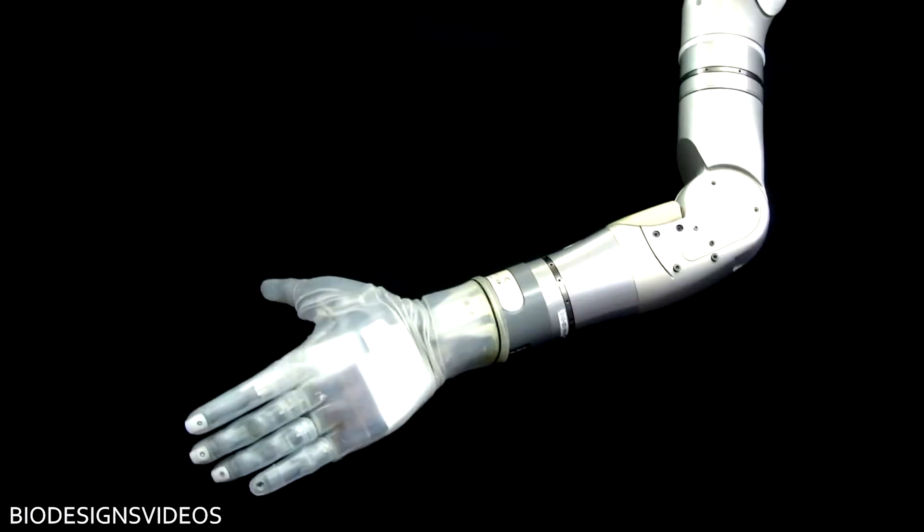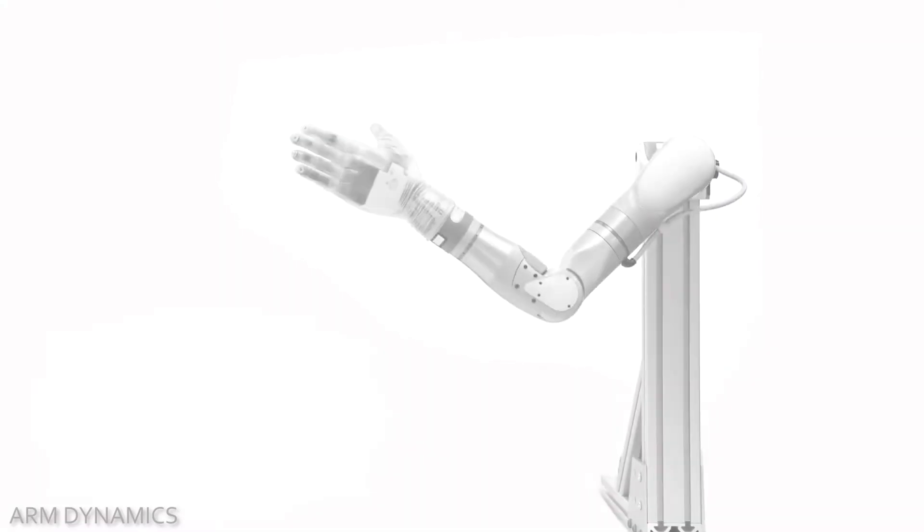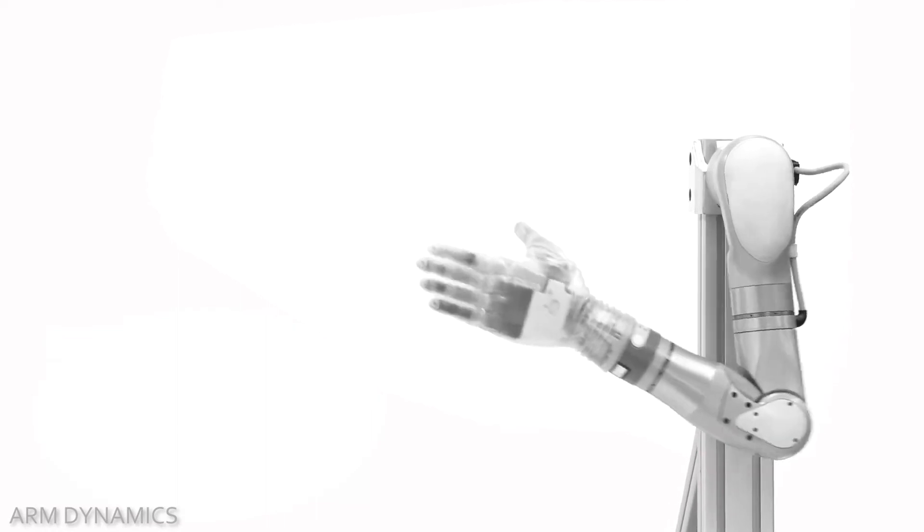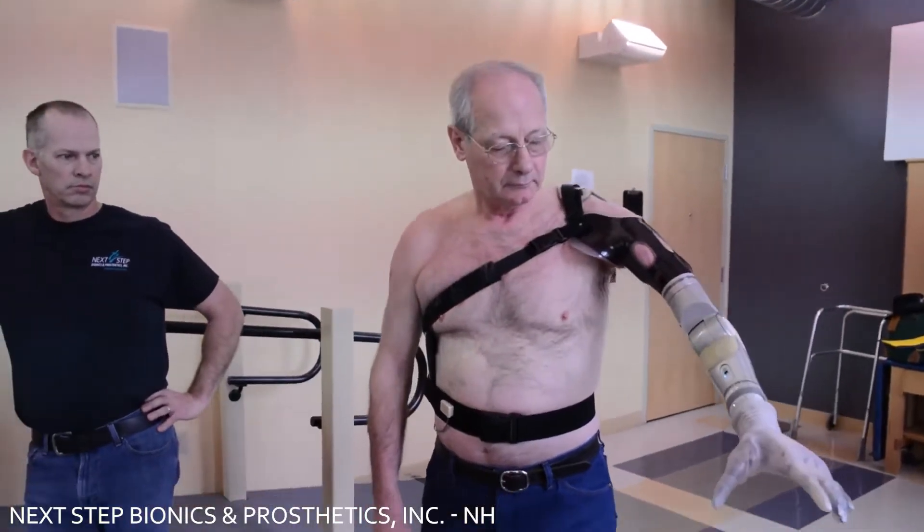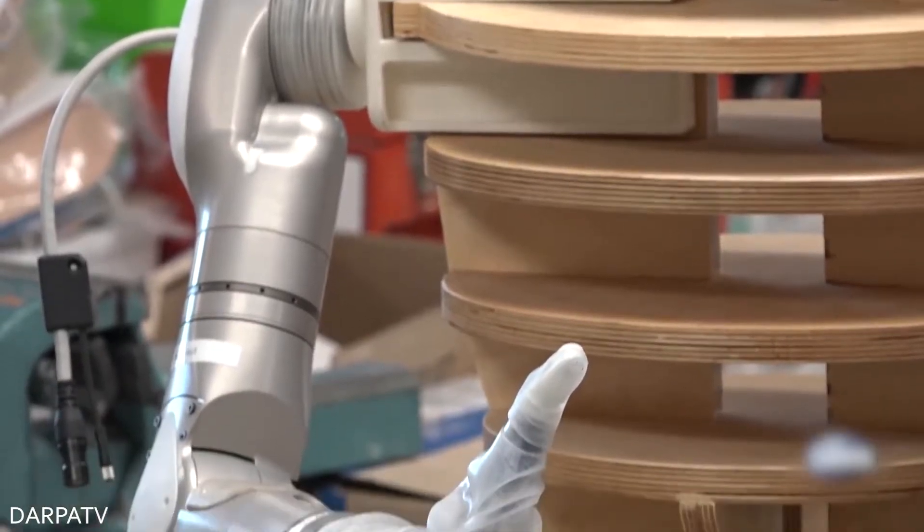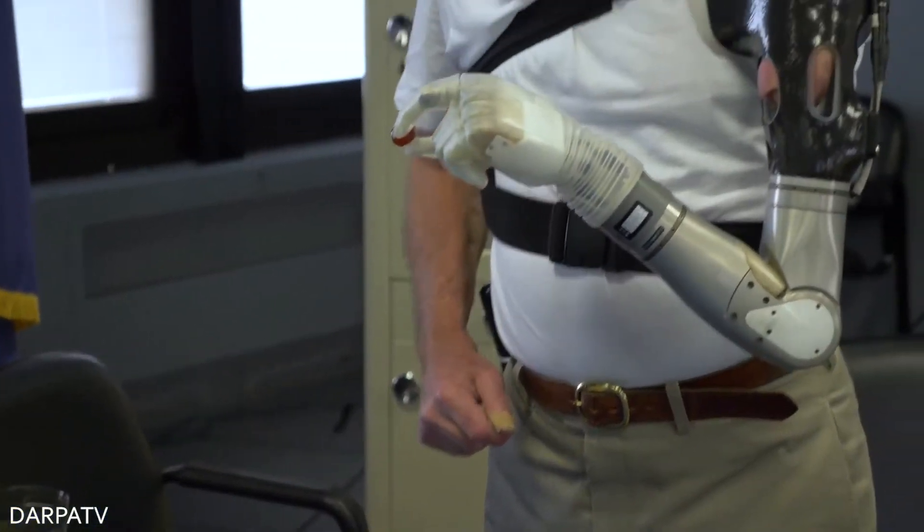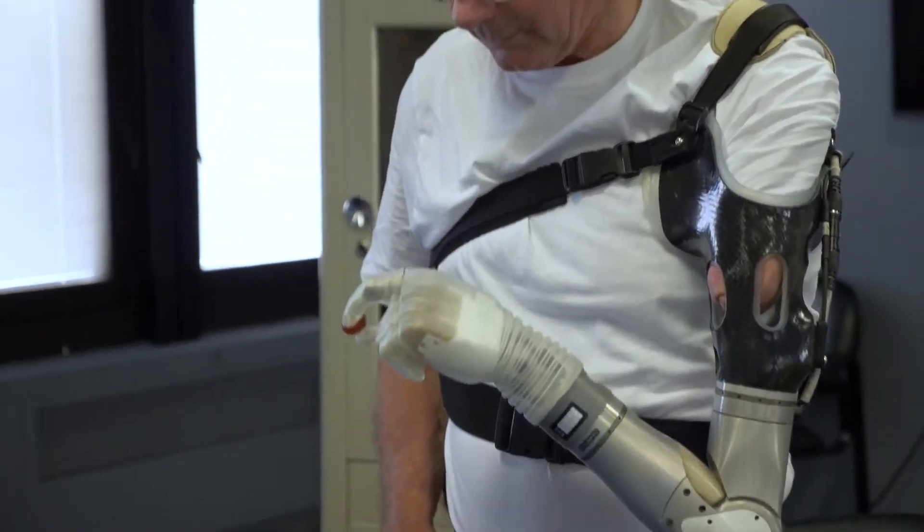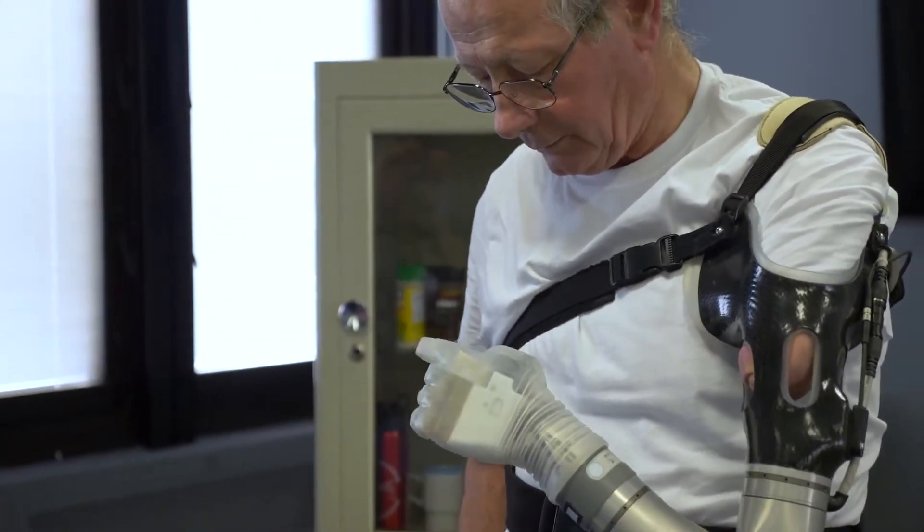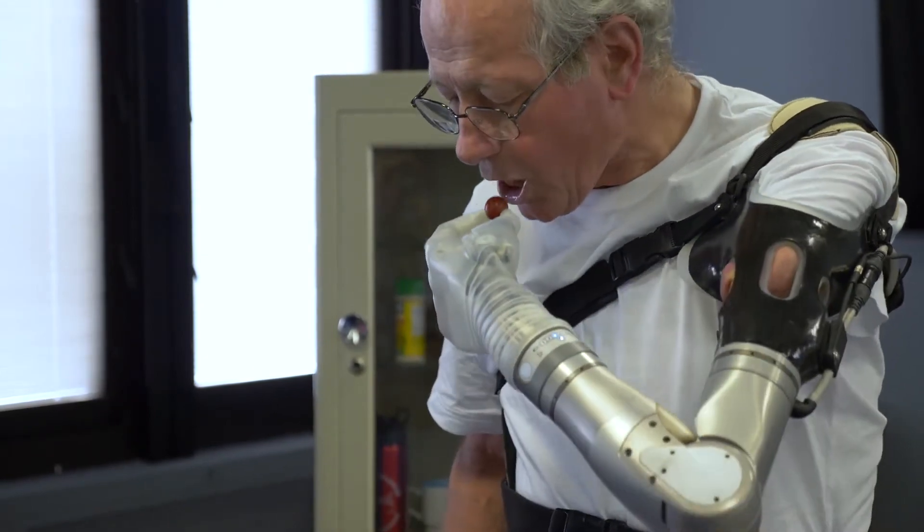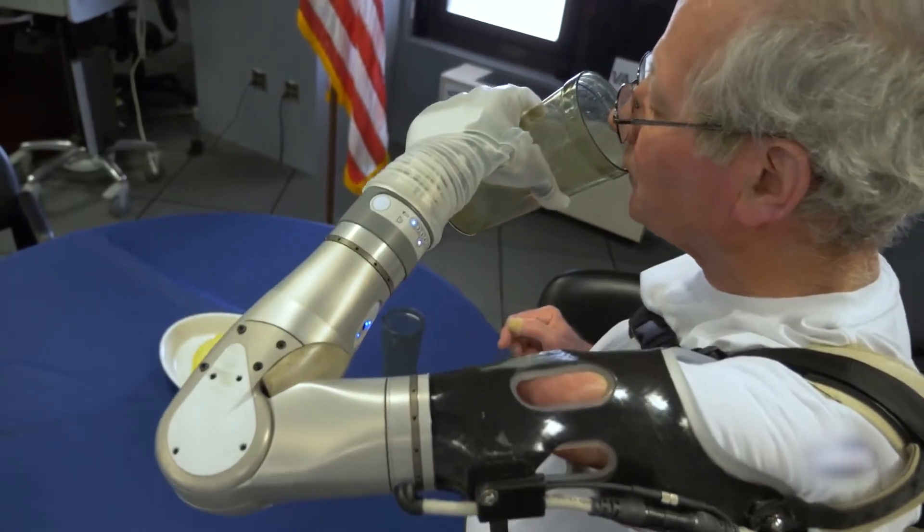Number 8. Luke. Luke, or Life Under Kinetic Evolution, is an arm that has been under development for 10 years. It has been tested by 100 amputees and used for over 10,000 hours. It allows people to perform more complex tasks than they can with current prosthesis in a way that better resembles the natural motion of the arm, and it comes in different configurations.